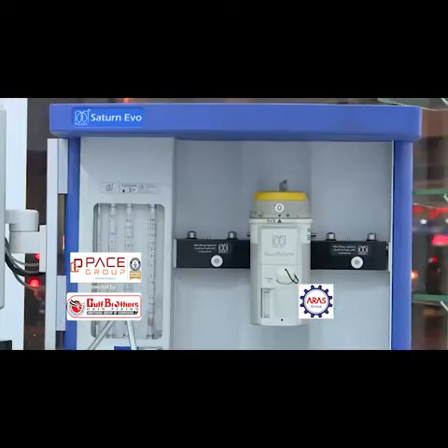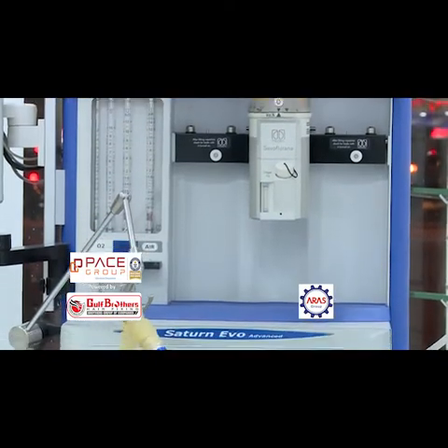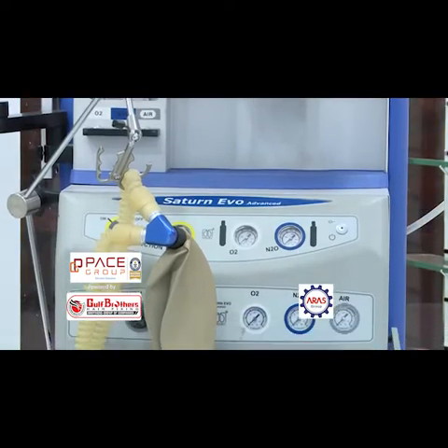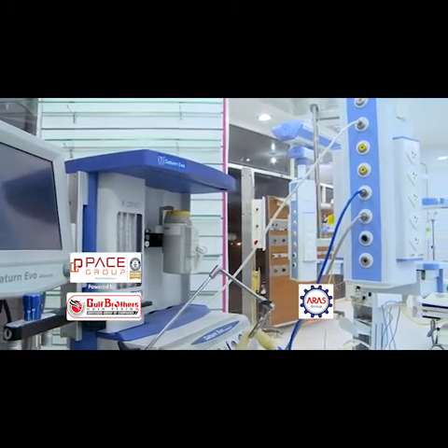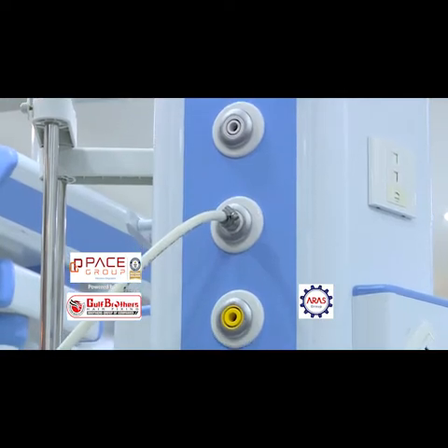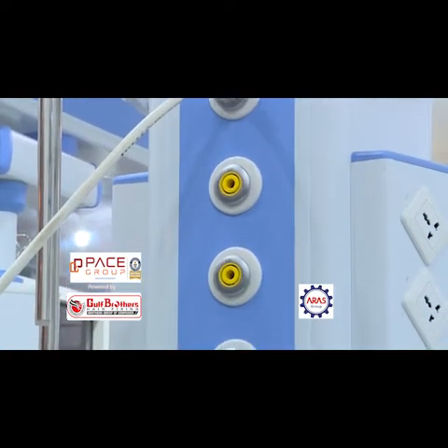Then whatever nitrous oxide you are giving for anesthesia, you take out and it goes to the AGS. That is the connection to the outlet we are talking about. This AGS outlet is here. We take it out from the room and exhaust it to outside.